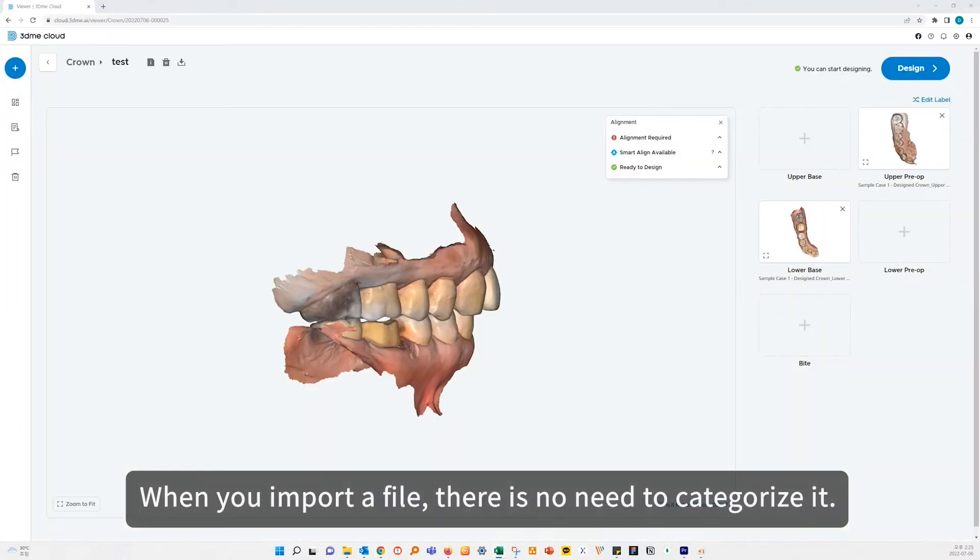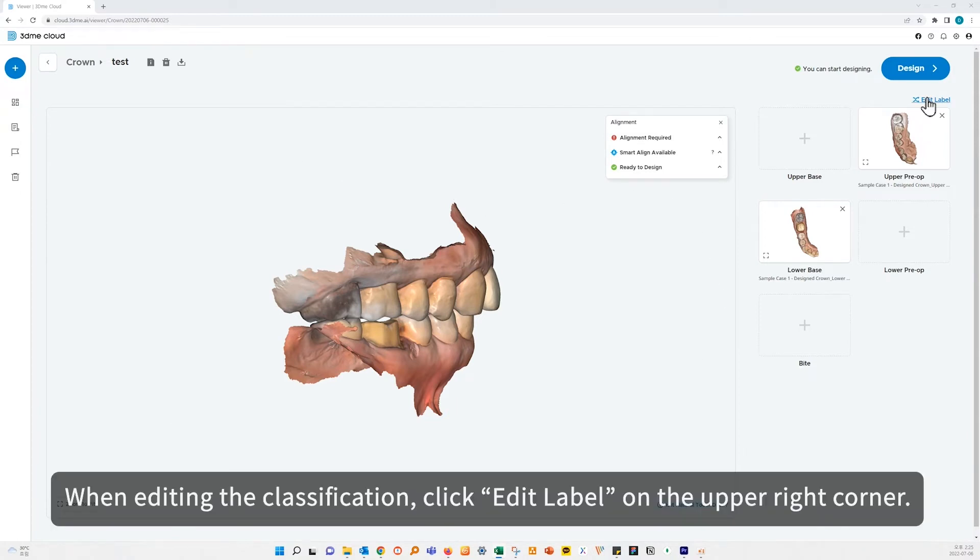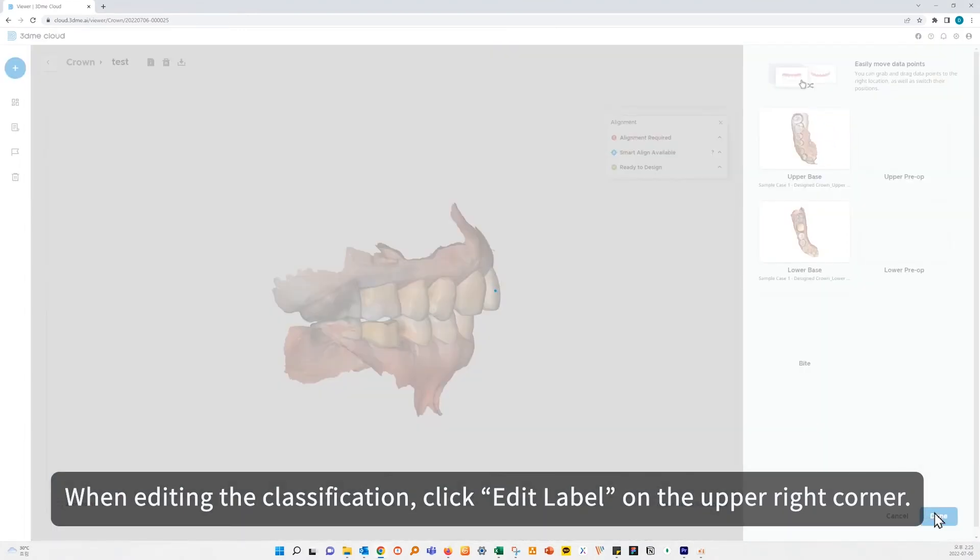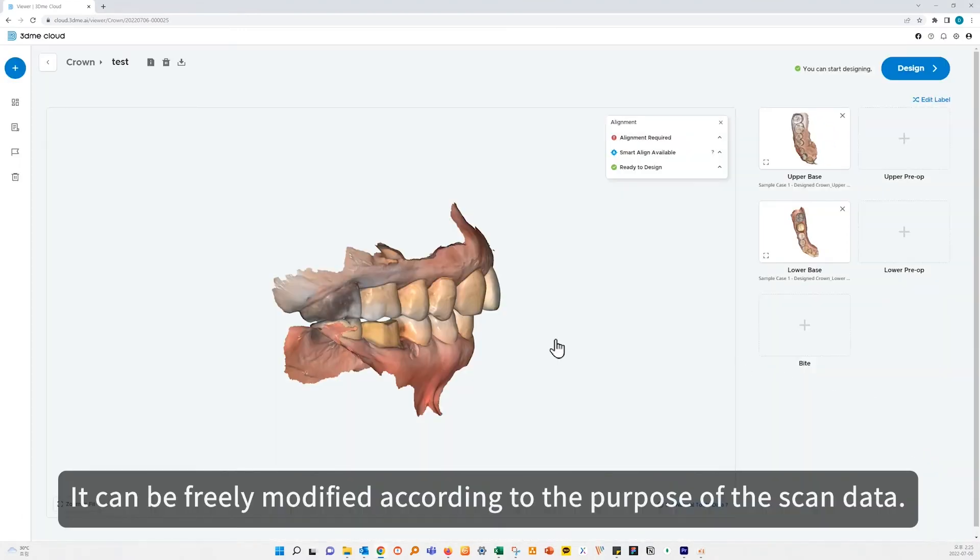When you import a file, there is no need to categorize it. It is automatically classified through AI analysis. When editing the classification, click edit label on the upper right corner. It can be freely modified according to the purpose of the scan data.